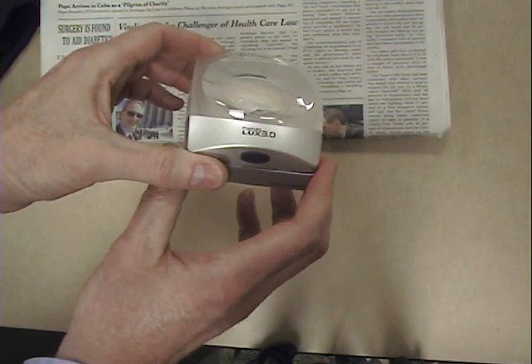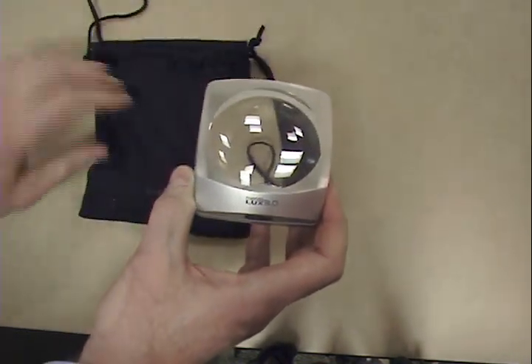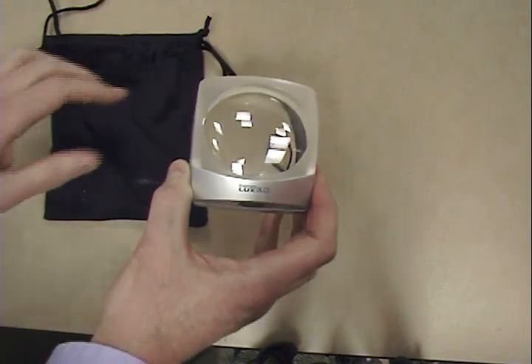A drawstring pouch, which doubles as a cleaning cloth, is included and will protect the Minus Lux from scratches and keep the lens clean.